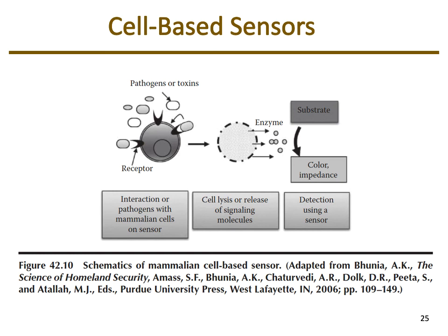potentially GFP or a bioluminescence sensor, and individual cells are going to be more sensitive than what we can see and what a lot of these different methods allow. So if they sense a pathogen or toxin, they turn on the genes for the signaling molecules because they're tied together in cell signaling pathways, because that's how the cells have been engineered.